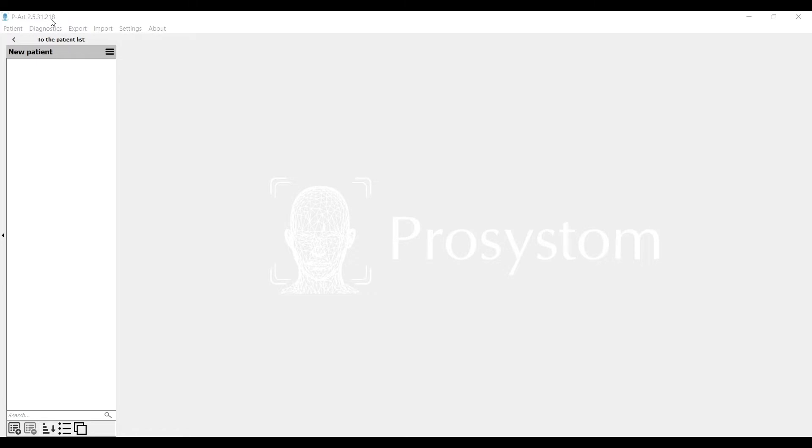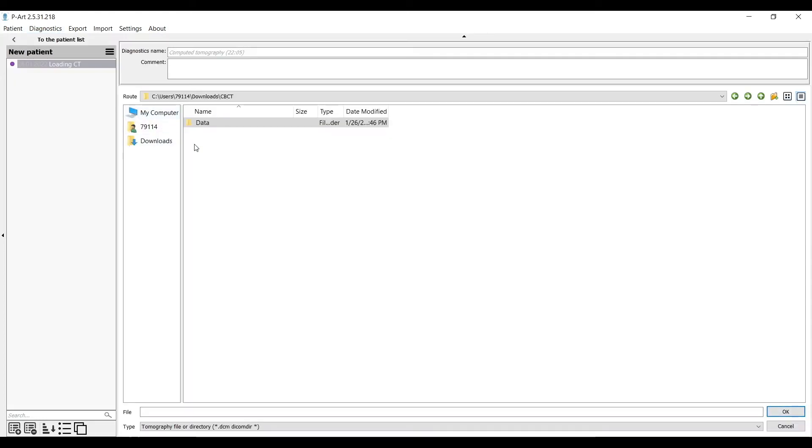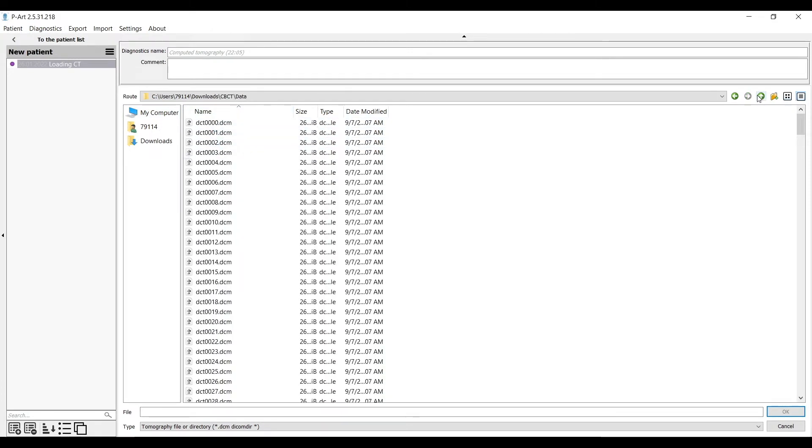To upload CBCT data, we click Diagnostics on the top menu and choose Tomography Load. Then we browse for the needed file. It can be two types: multi-file or single file.